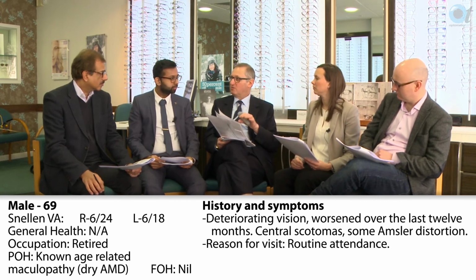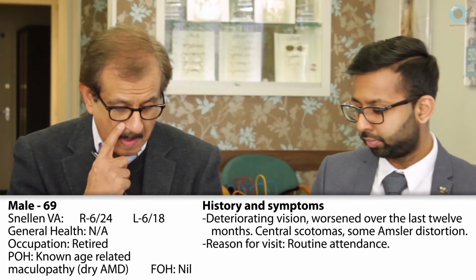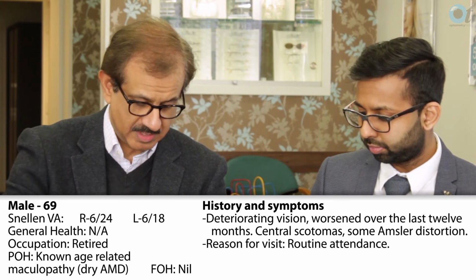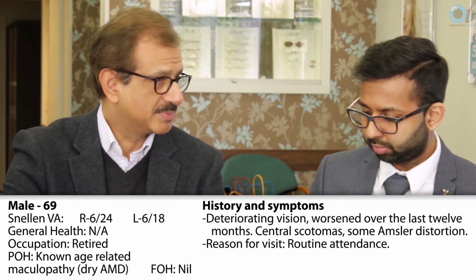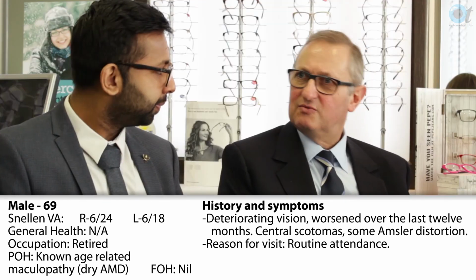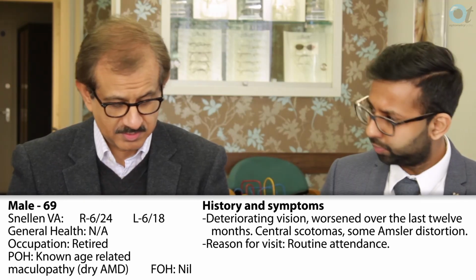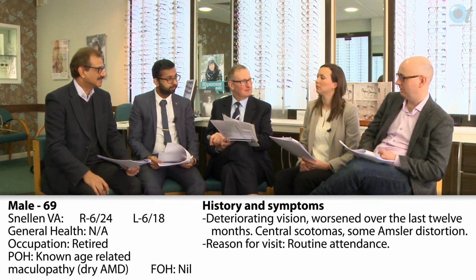We agree. Over what period of time would you do that? When would you have him back to repeat the OCT? Oh, the first OCT I would repeat straight away because it may be better to focus a little bit higher, a little bit lower, the absolute central part of the macula, to see if anything shows up from that. And if you were still unsure, were there any consulting room tests that you might do to help you? Or the one I love to do is pinhole. Pinhole? I like my pinhole. And Amsler, you could issue the patient with an Amsler so they can monitor at home.